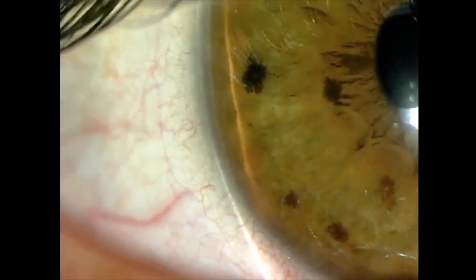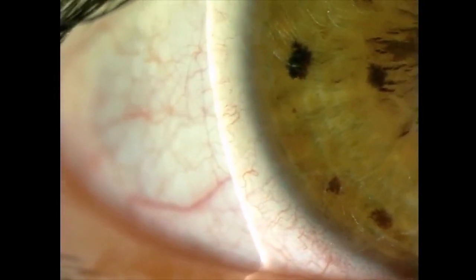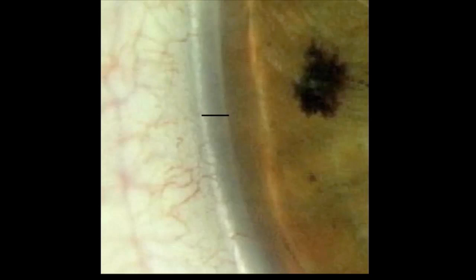And then I'm going to use the thickness of my cornea as a ruler, and with that ruler, measure the anterior chamber depth. So this is a young myopic patient, and you can see that her anterior chamber is deeper than the cornea is thick. And so this is a very deep grade 4 angle, not likely to close.